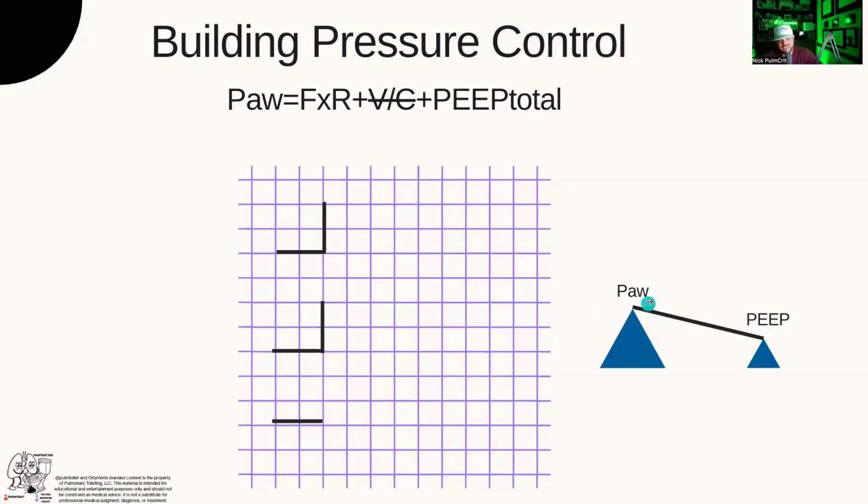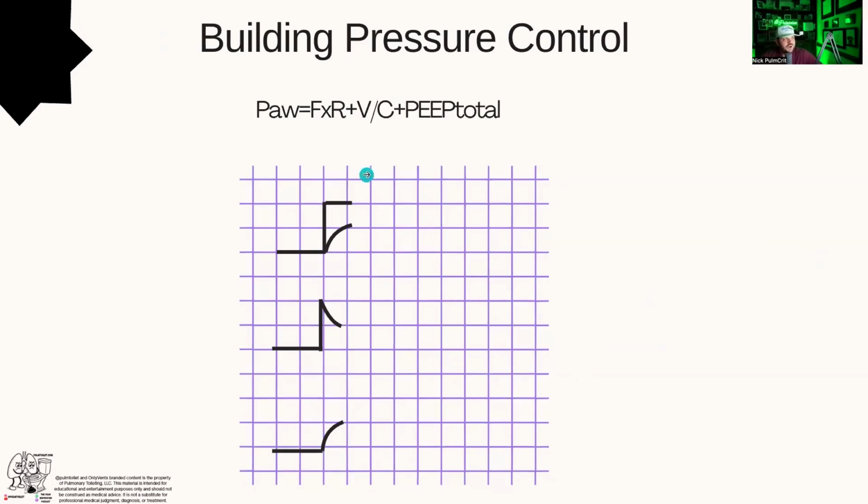If you can imagine, in the airway you have this big pressure. At the alveolus, you're at PEEP. So now you have this big delta. So you're going to have flow over time, i.e. a total volume. As you move through the breath cycle, let's just say this is 1 second. It's just easy to make the math and to think about it in your mind. And remember, in pressure control, much like in PRVC, we set the inspiratory time. That's one of the things that makes it pressure control: we set the I time.